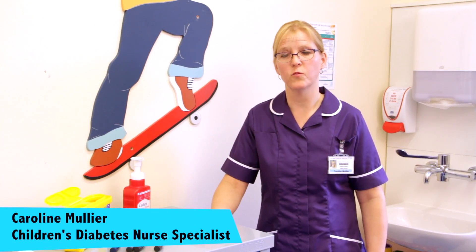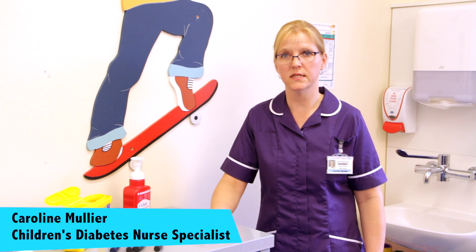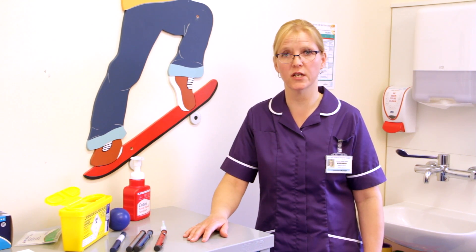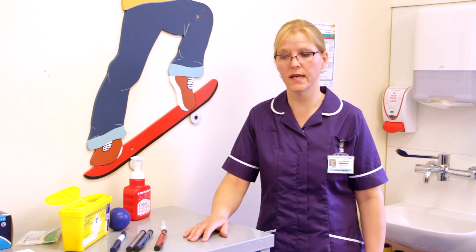Hello, I'm Caroline Mullier. I'm one of the children's diabetes nurses and I'm going to talk to you today about how to give an injection of insulin using a pen device.